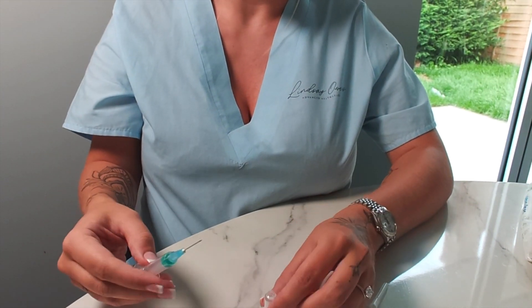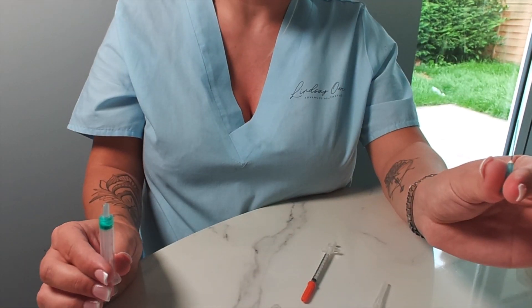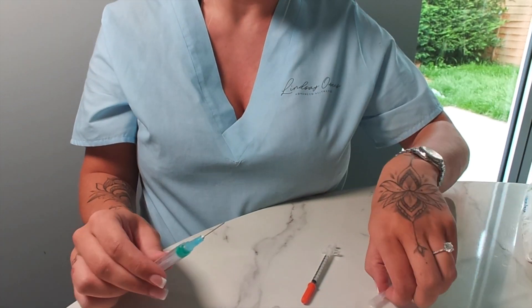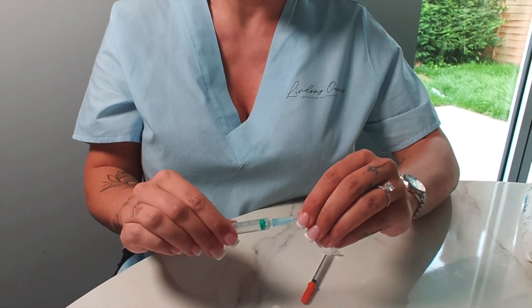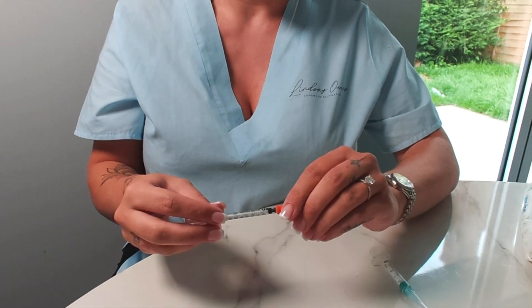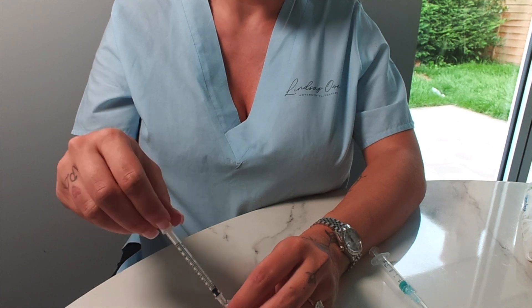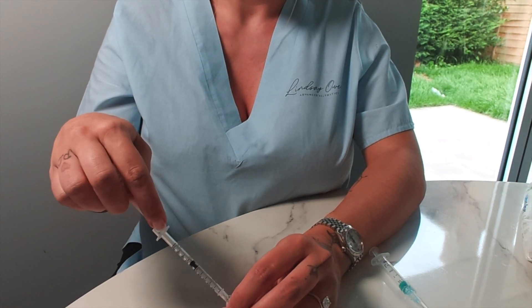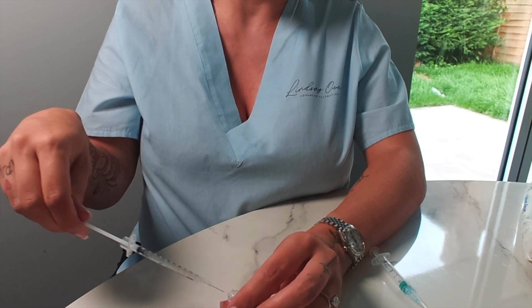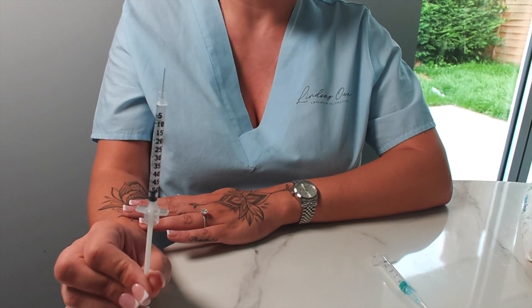If you are going to inject 2ml, it's probably easier to draw the whole lot up in the 2ml syringe, swap the needle over for a 30 gauge, and then use that to inject with. Because I only inject with a 1ml solution, I have it mixed up in the 2ml syringe and then transfer to my insulin needle, drawing up what I need — for instance 1ml or 0.5ml. These insulin needles are 0.5ml so you can do it in 0.5ml increments. That is your solution ready to inject.